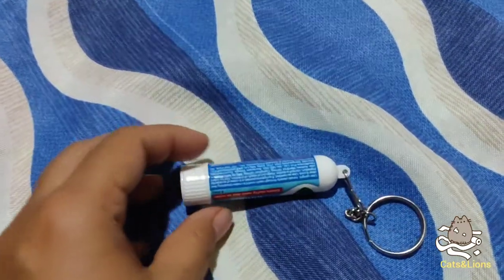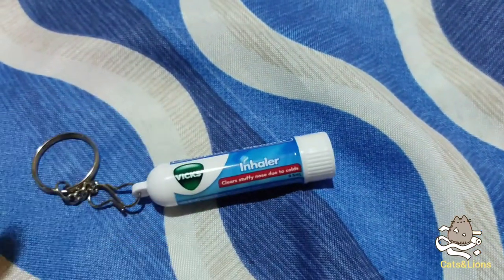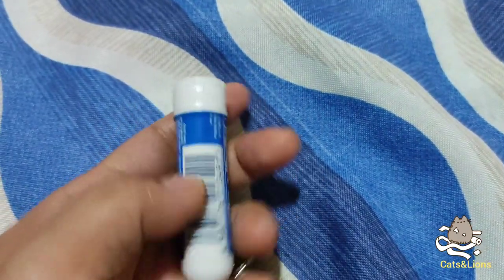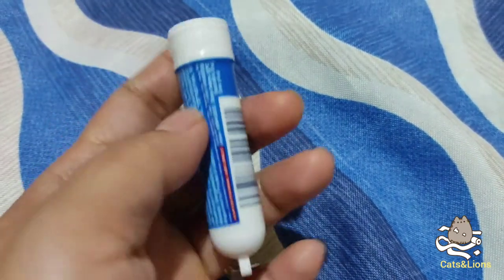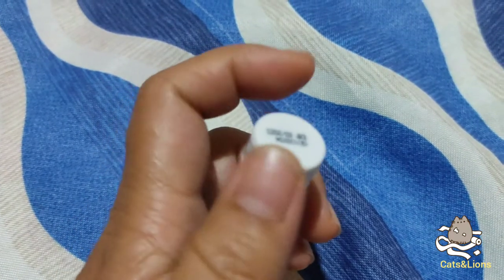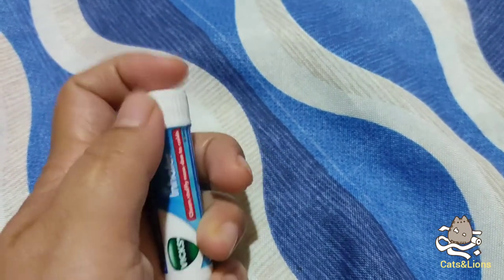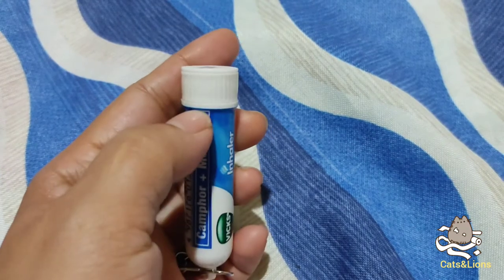By the way, if it's going to be your first time to use this product, there's actually a plastic packaging surrounding this plastic tube. You don't have to rip that off — you just have to rotate it counterclockwise using both hands, and the plastic will just split into two parts.